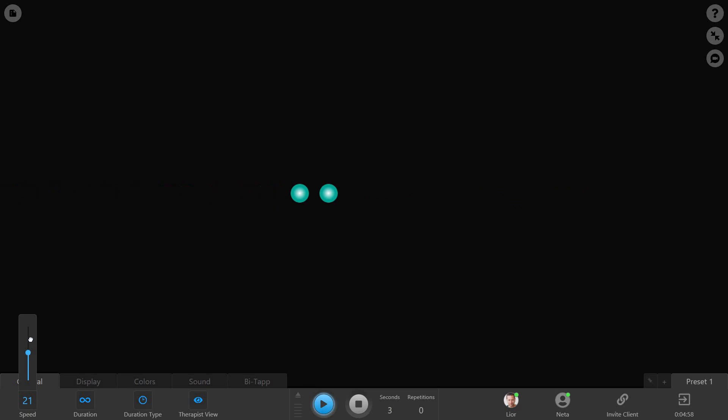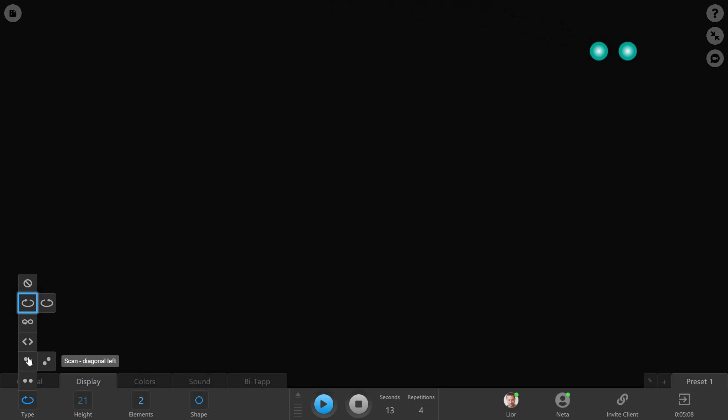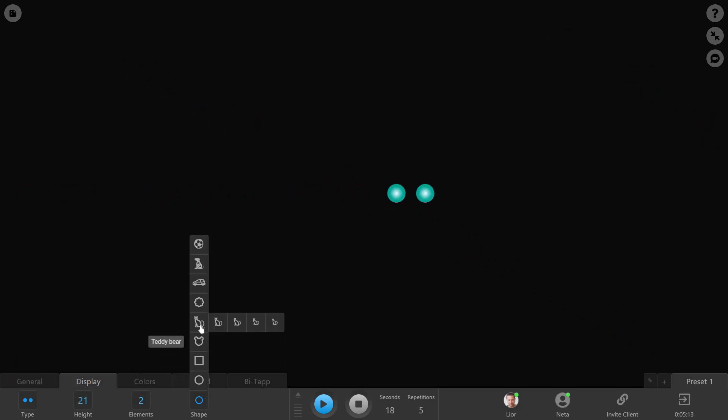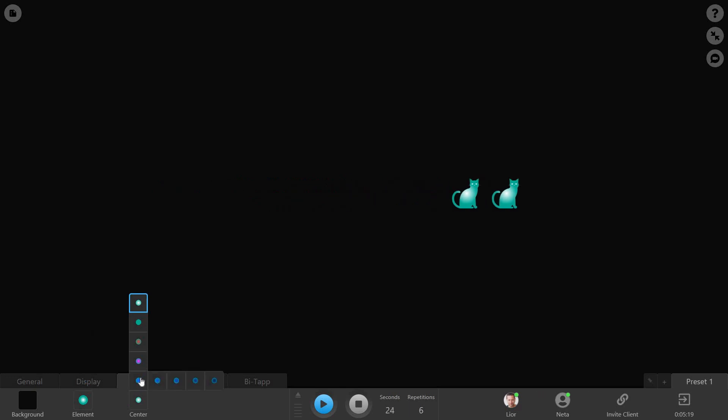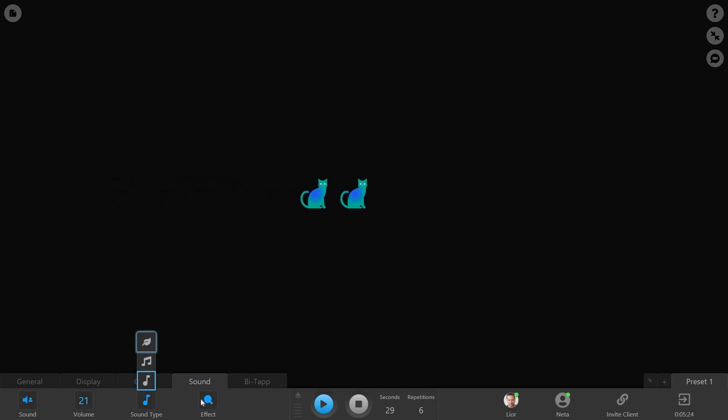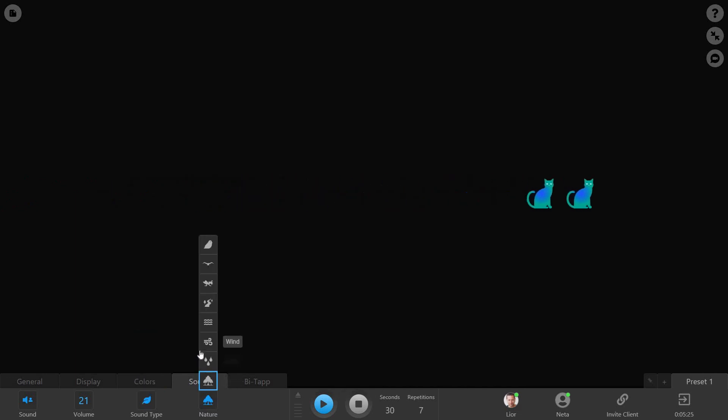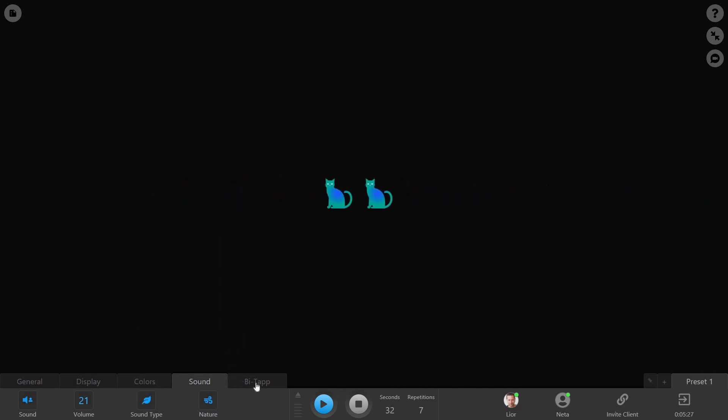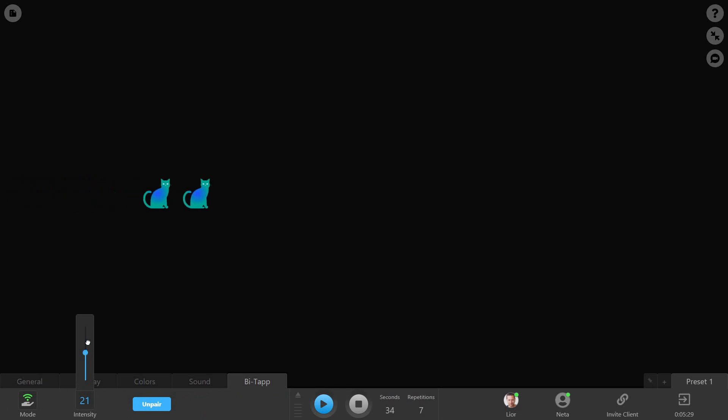You can change the visual elements' speed, their movement type, their shape and colors, the auditory stimulus, the tactile stimulation's intensity, and much more.